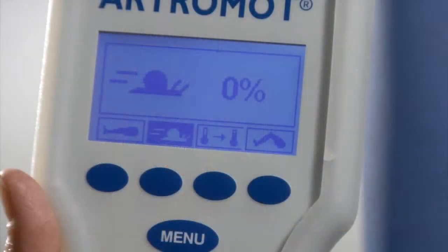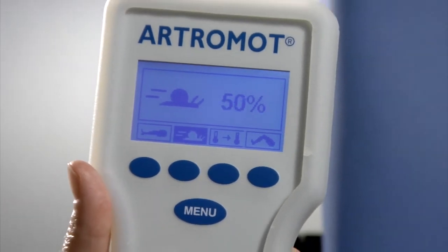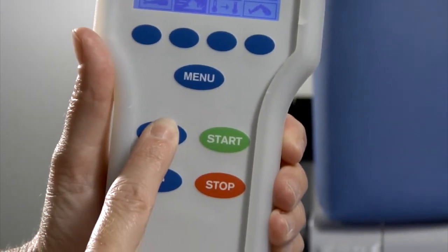To the right side of the extension symbol on the display is a picture of a snail. The snail picture represents the speed at which the machine will run. To adjust the speed, press the blue button beneath the speed setting and change using the appropriate arrow.